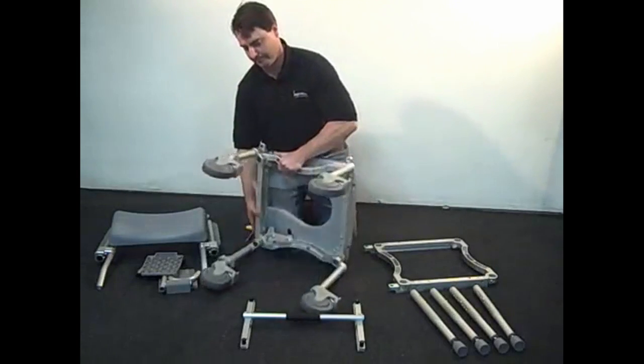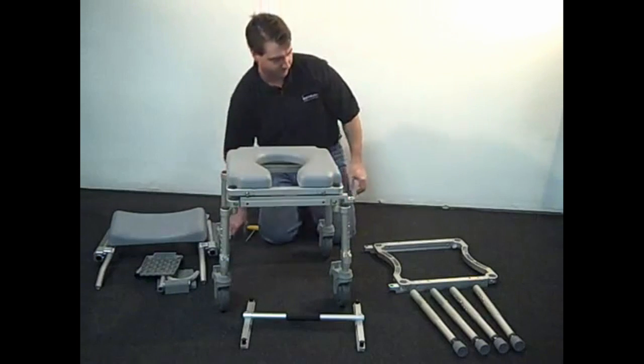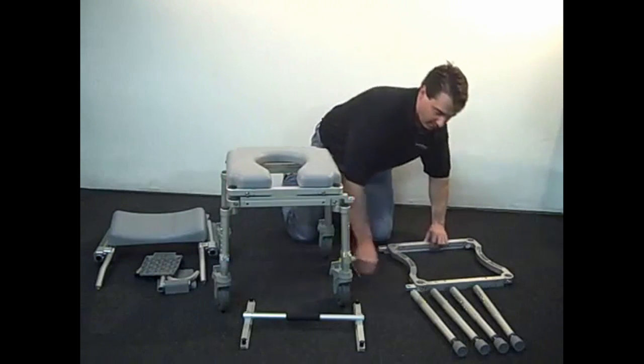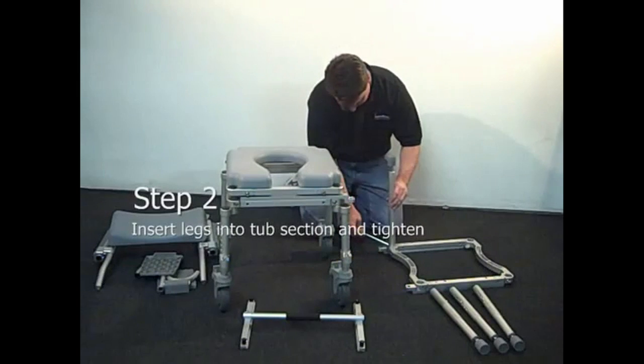Once all four legs are installed, flip the frame right side up. Next, install the four non-offset legs into the tub section frame.